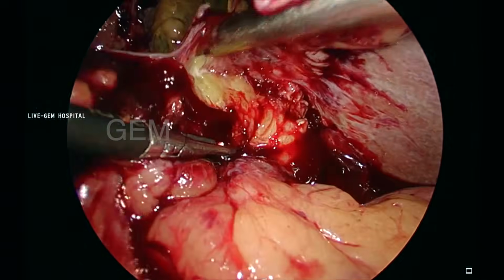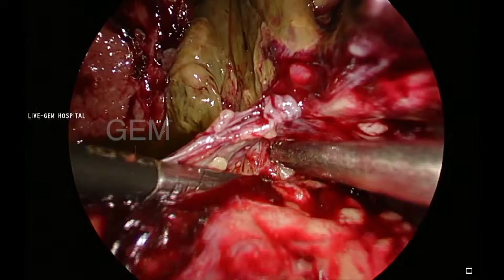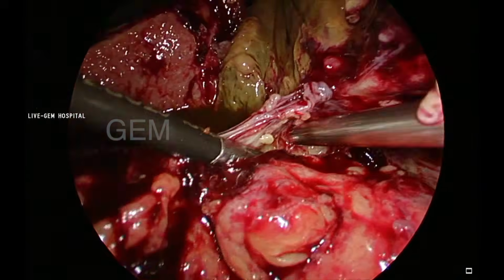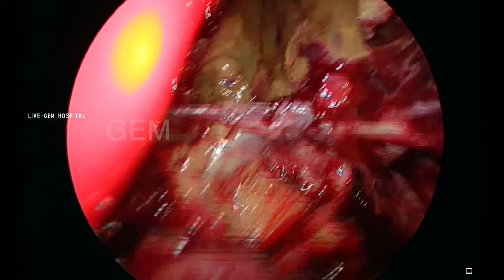So I am trying to separate on the medial side from the quadrate lobe. If I see the anterior wall of the gallbladder, I can take out the omentum. So this type 1 modification will be avoided. So just I am looking for that.